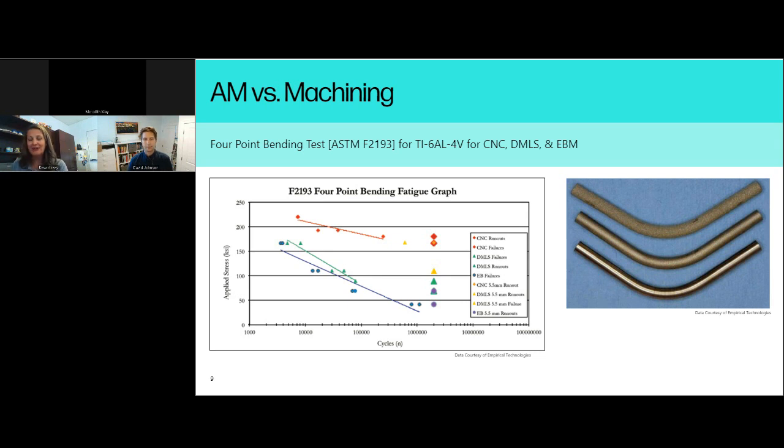And by the way, this is really the only industry where we care about particulate still being in the part, and that it's actually clean and sterile. Aerospace, not so much, right? So when we go through it, it's the entire process that's been frozen, and that's what has been cleared by the FDA. If a medical device manufacturer wants to go to a different contract manufacturer, then we have to go through some additional testing to validate that new manufacturer and that process and show that there isn't a difference. But when you have all these different technologies and all these different potential variables with additive manufacturing, that's where the scrutiny in the risk assessment and the quality system requirements come into play at a much, much higher level, much more detailed, granular hows and whys when it's an additive manufactured part.